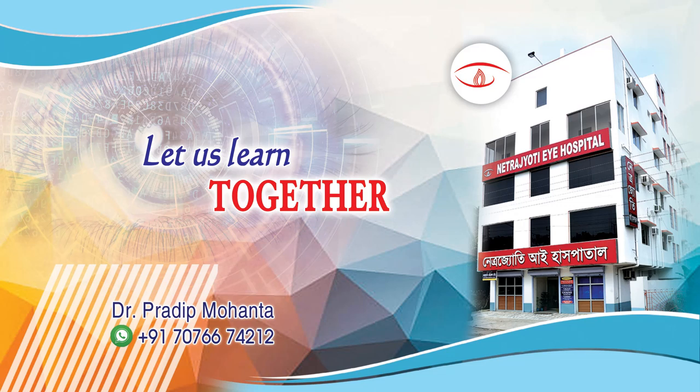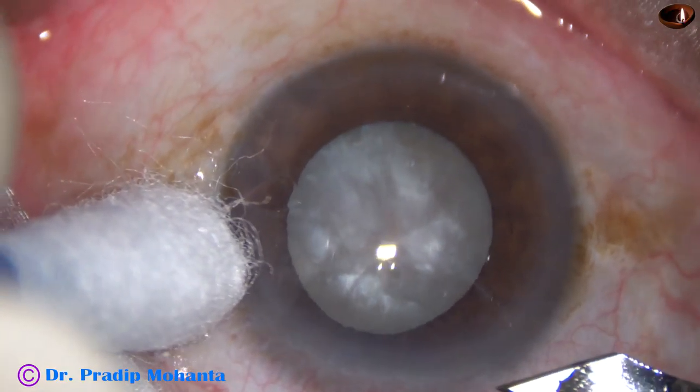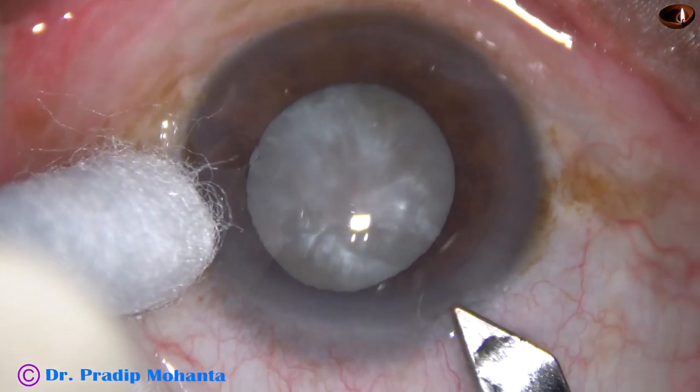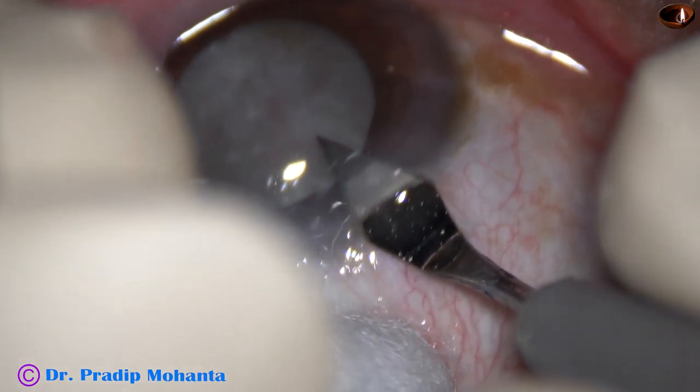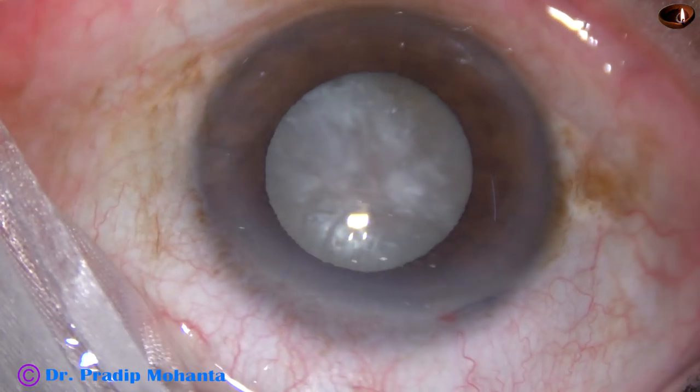Friends, welcome to my workplace at Ranaghat, West Bengal, India. This is a hypermature cataract with fibrosed anterior capsule with a very hard nucleus. Let us observe this surgery.